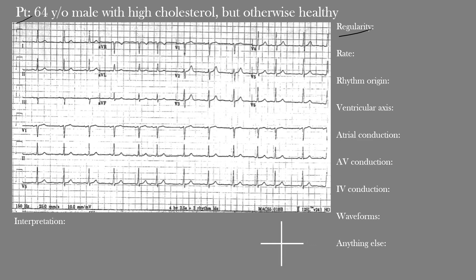I want you to pause the video and take a few minutes to go through it yourself. When you're ready, start the video and we'll go through it together. So our 64-year-old male with high cholesterol and no other significant medical history brings us his EKG. On first impression, the rhythm appears a little irregular in some areas but then regular in others, so we call this a regularly irregular rhythm.